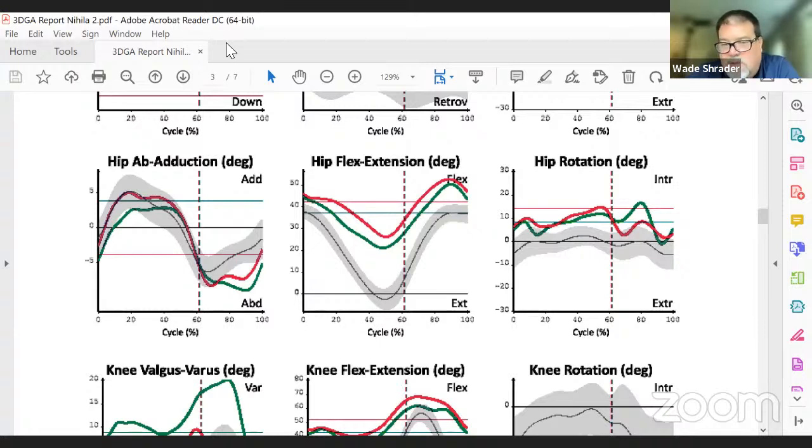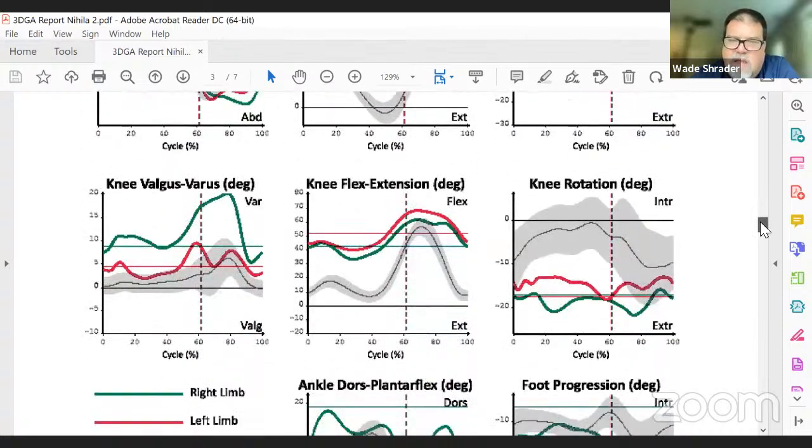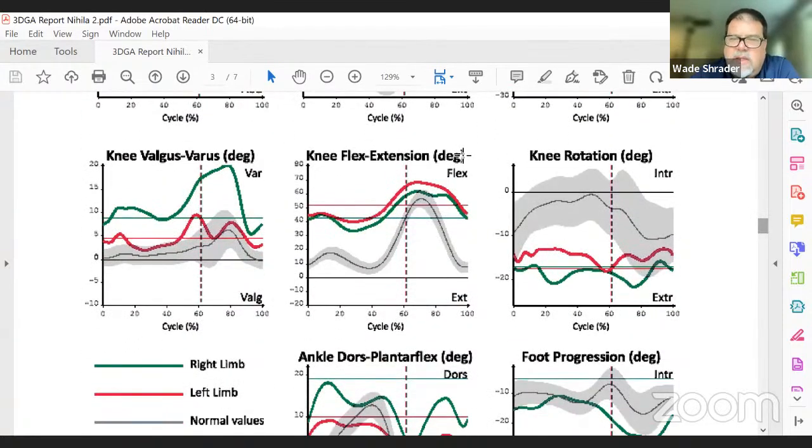It's fairly symmetric actually between left and right, but for whatever reason, she's compensating more for that left-sided internal rotation with her pelvic retraction. Okay, so basically we are not getting more information on the hip side, except yes, the hip remains in flexion. I think this confirms it a little bit. There were definitely gait cycles where I thought she looked a little internally rotated. I think that confirms it there.